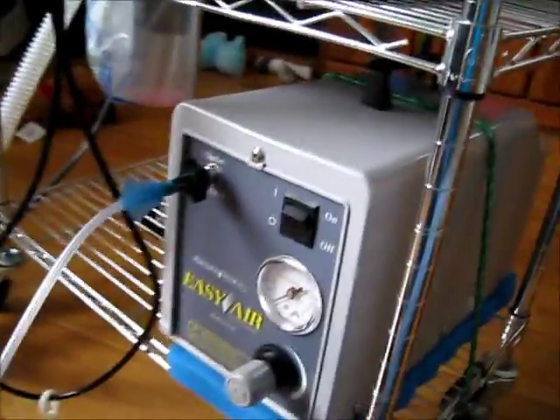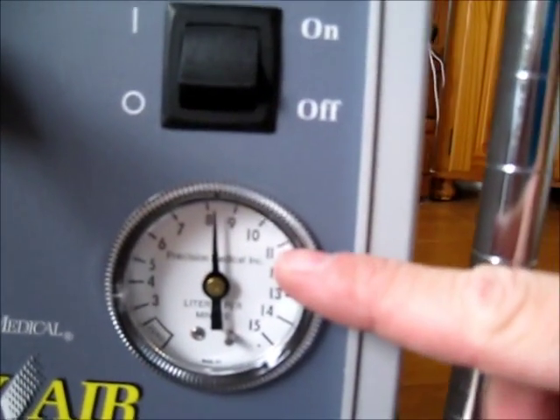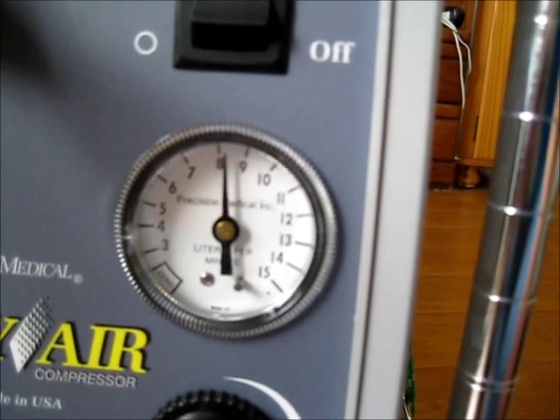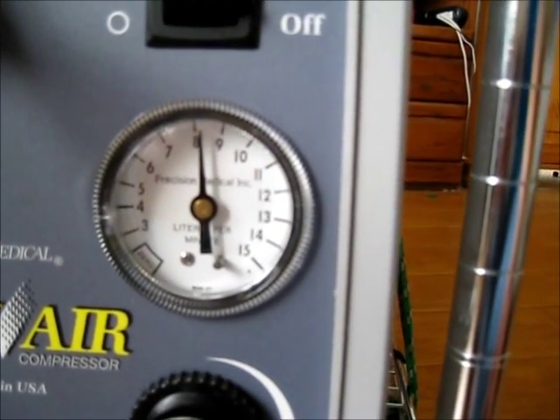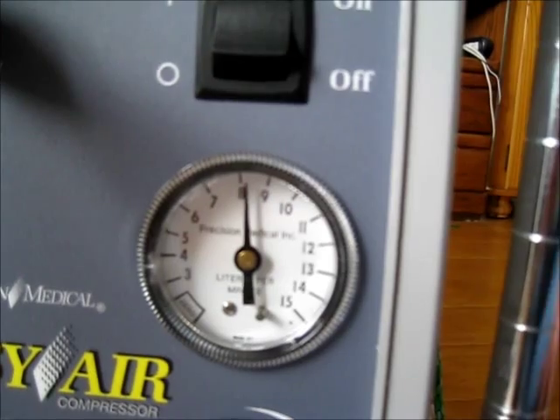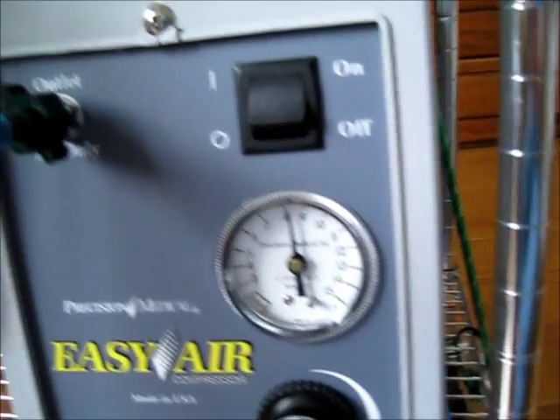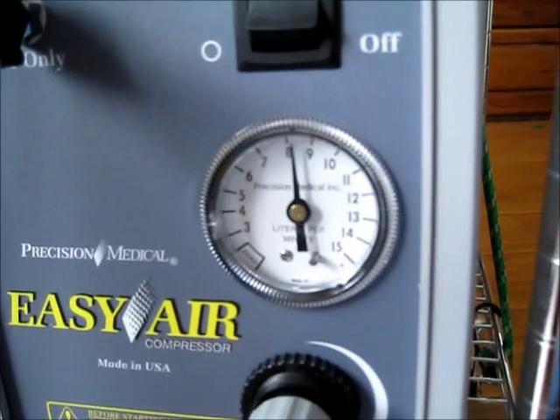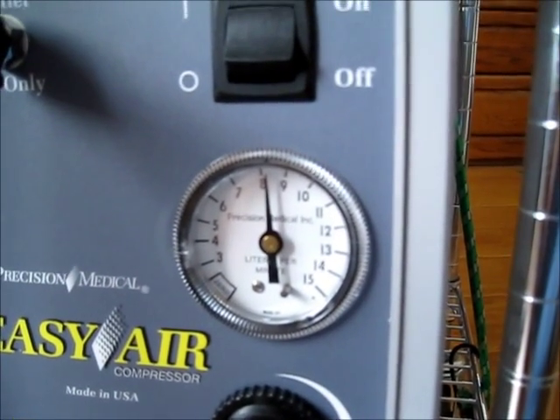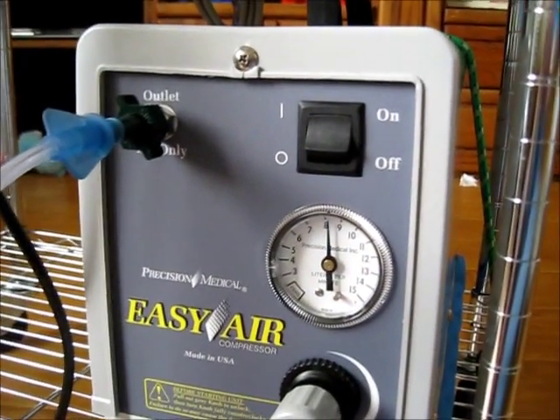I'm going to have Michael start his mask — and that's actually on. We're so impressed. Do you guys see this gauge right here? We're looking at eight liters per minute flow, which is obviously different than PSI. That was the hardest thing to figure out in this equation, because the PM50 or 50 PSI compressors don't really give you the gauge. Here's Michael going with the Nebcot. Talking to numerous people — I want to give a shout-out to George and Oscar from Aperil Healthcare, and also Andrew Brown at Precision Medical for helping us out with this. I'm pleased as punch.